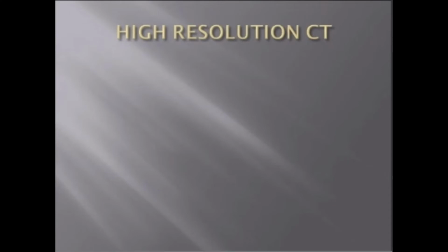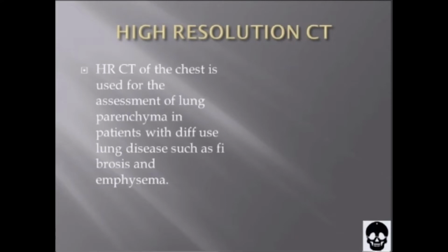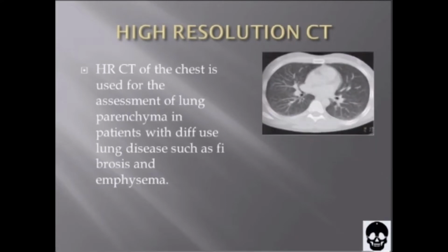High-resolution CT. High-resolution CT of the chest is used for the assessment of the parenchyma in patients with diffuse lung disease such as fibrosis and emphysema. This is the high resolution of the chest CT.